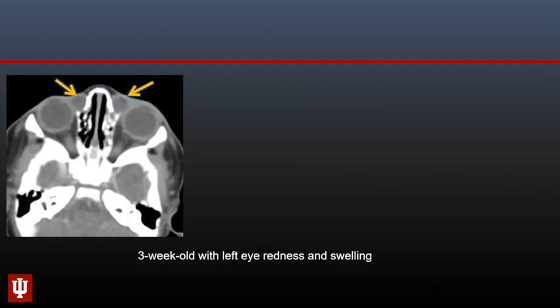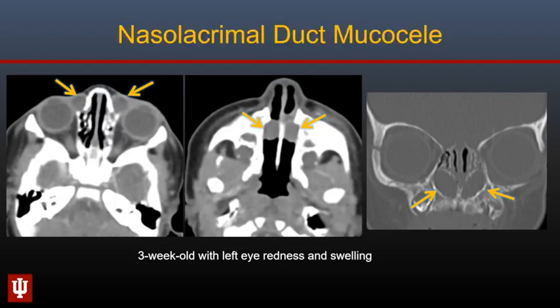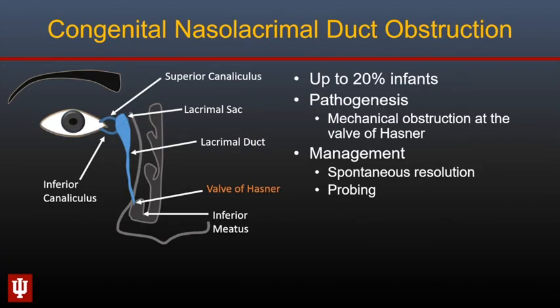To start with, here is a three-week-old who presented with left eye redness and swelling. There are two cystic structures along the medial aspects of both orbits. These structures are tubular and expand intranasally with expansion of the inferior meatus — this is nasolacrimal duct mucocele. These occur because of congenital obstruction of the nasolacrimal duct at the level of the valve of Hasner, where the lacrimal duct enters the inferior meatus. They may be associated with complications such as dacryocystitis and may resolve spontaneously, though probing typically causes rapid improvement.